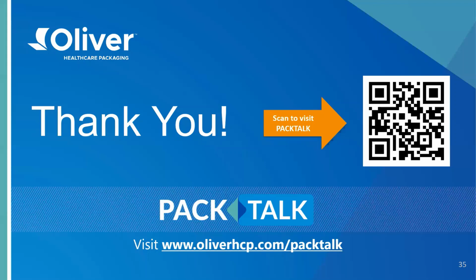So if that is the case, at least I'd say that once you have your design locked in and once you have your sterilization method locked in and agreed, it's at that stage you reach out to the packaging manufacturer, because, especially within all of our healthcare packaging, it's at that stage that we can support you from a design perspective. So, utilizing all those design features that we showed earlier on and the additional features if needed. And we can give you our perspective and our knowledge from years gone by.